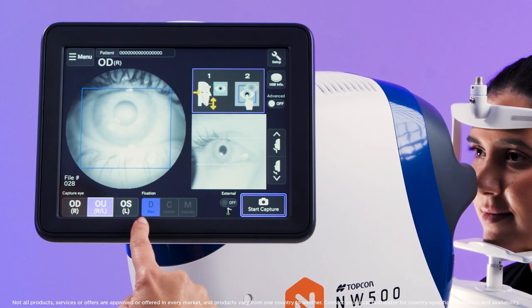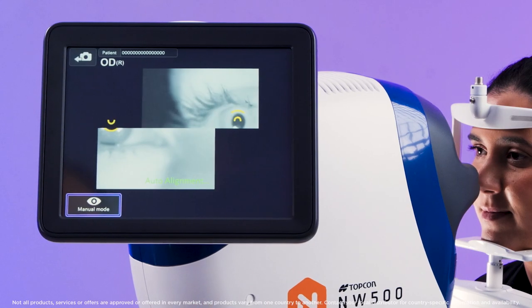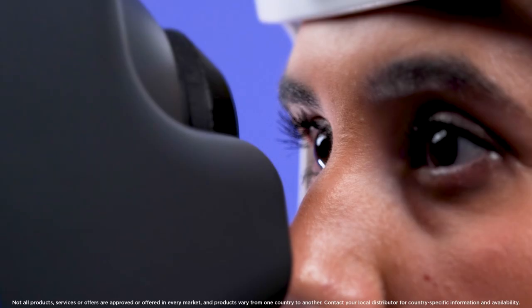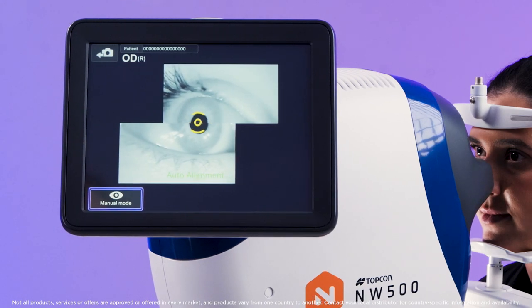Notice that the disc fixation is highlighted first. Press Start Capture and the device will automatically align and focus before taking the image. Once complete, the device will automatically move to align the macula.